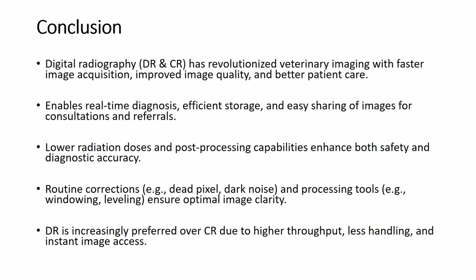Now finally we will conclude today's lecture with the following points. Digital radiography, DR and CR, has revolutionized veterinary imaging with faster image acquisition, improved image quality and better patient care.